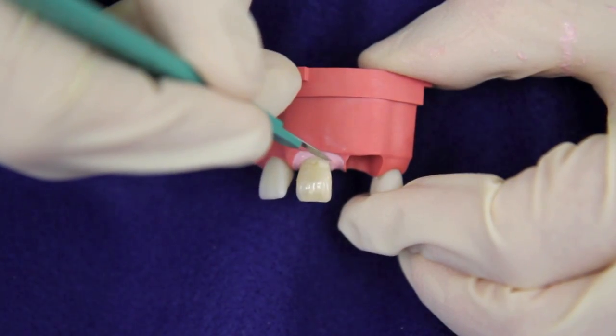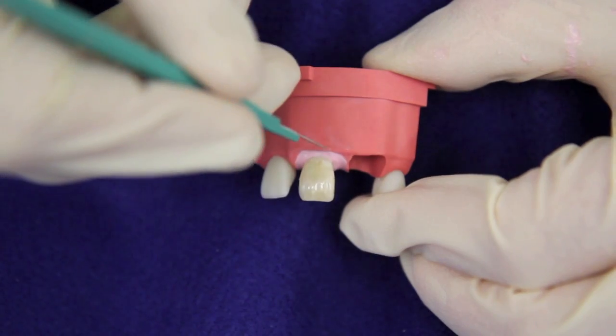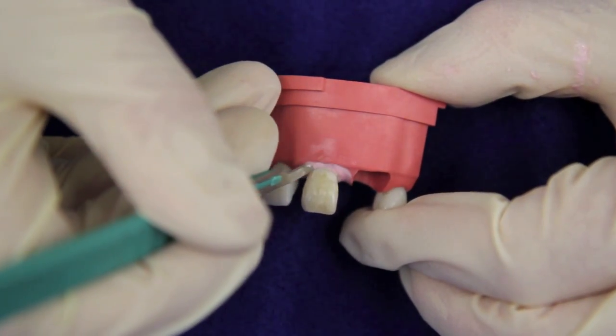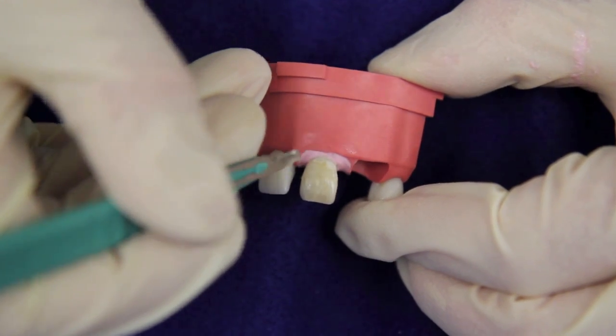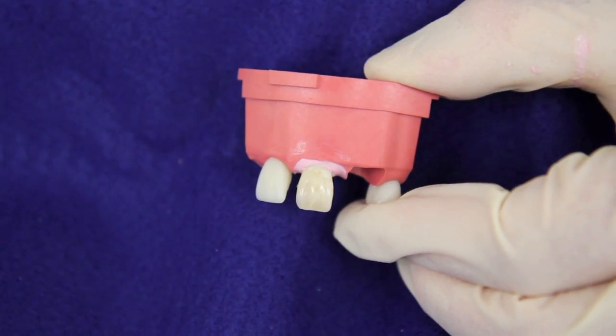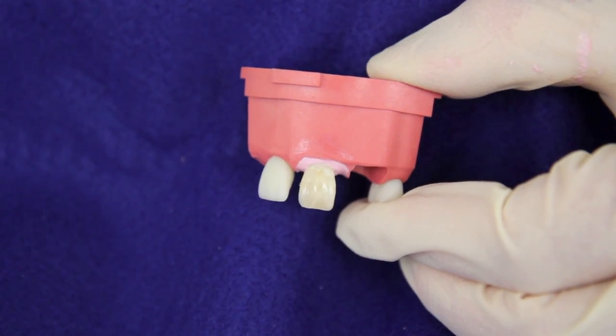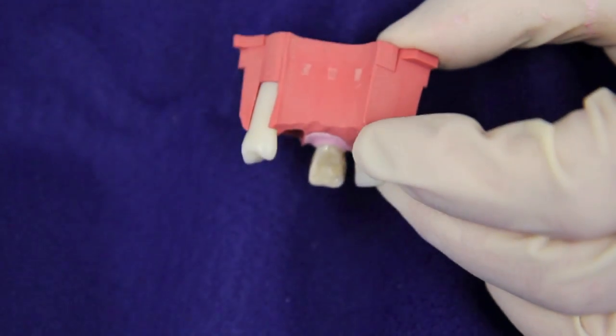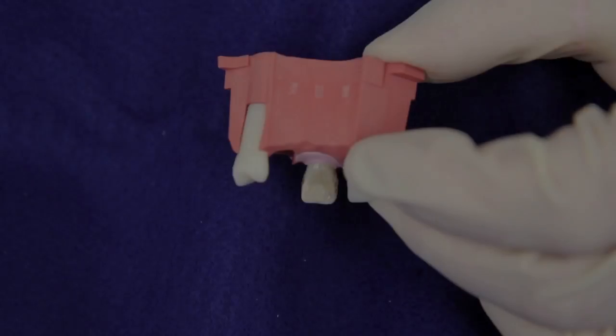Now we're cleaning up the excess flash with a sharp, disposable scalpel, to ensure that the CEJ is fully exposed, so that we can see the outline of the crown, and of the long axis of the tooth, both on the buckle and on the palatal.